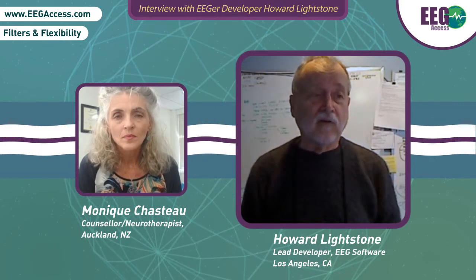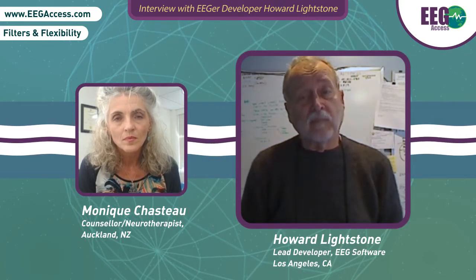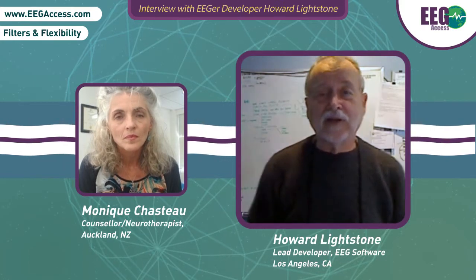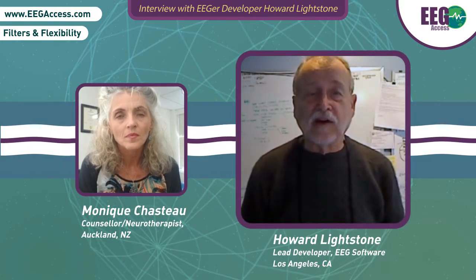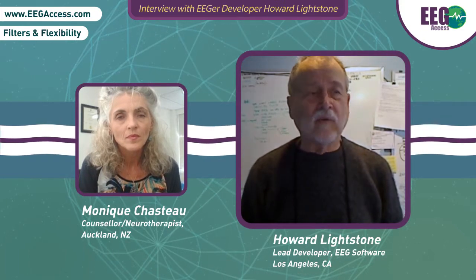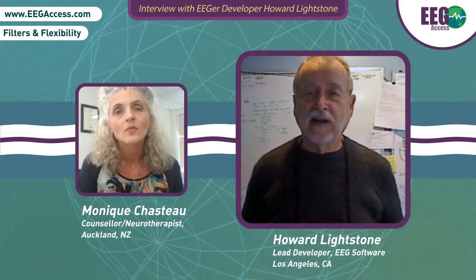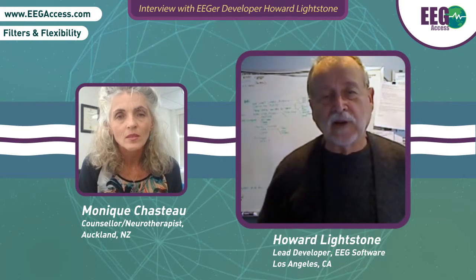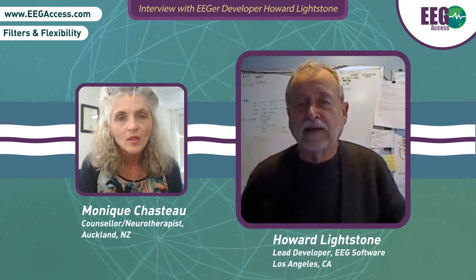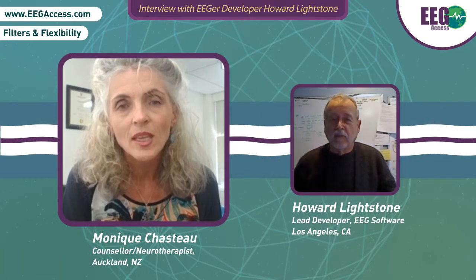A very narrow digital filter is possible, and I even have some, but we don't do that. It makes it tough. You don't know where you are, and then the brain goes, oh, there's where I am. Oh, wait, where was I? So I believe the proportional aspect of the band is important.